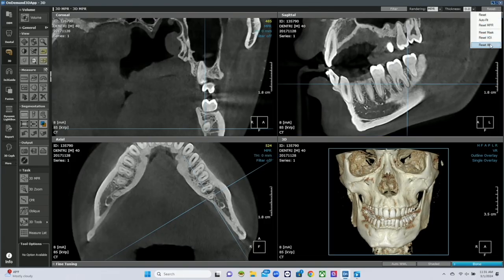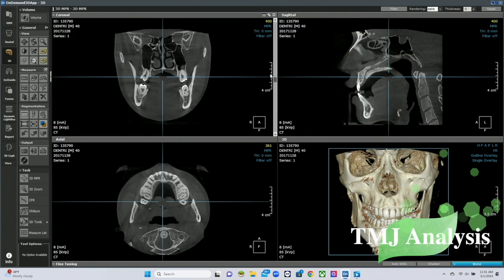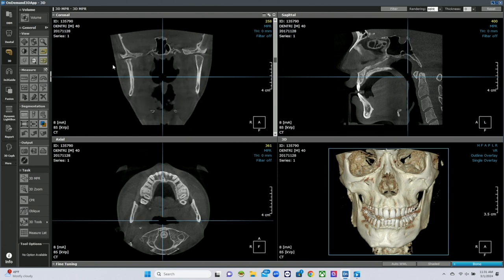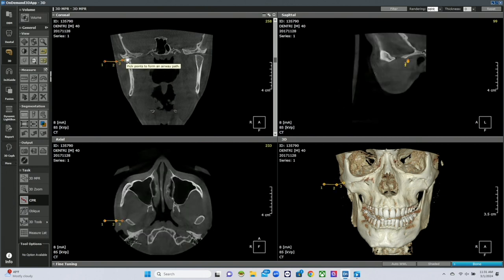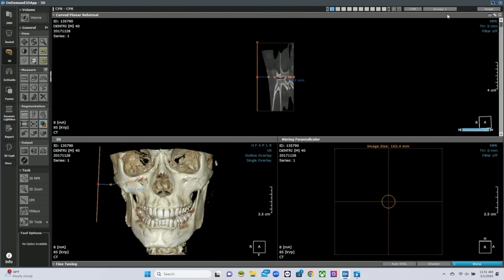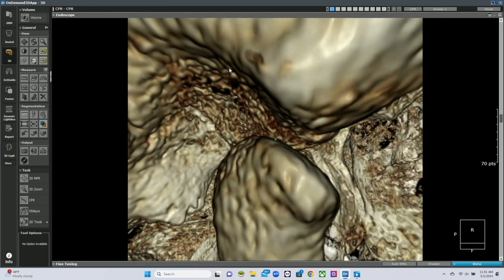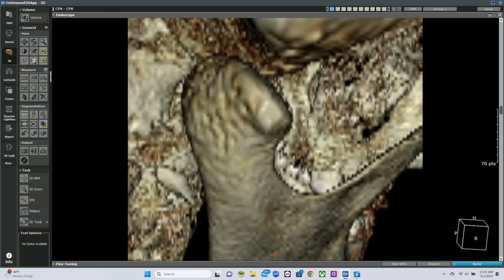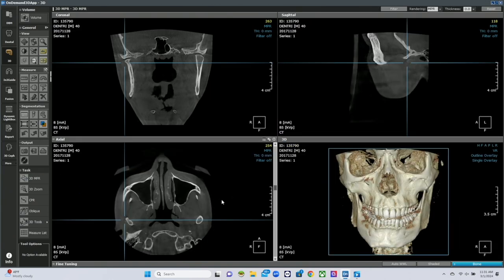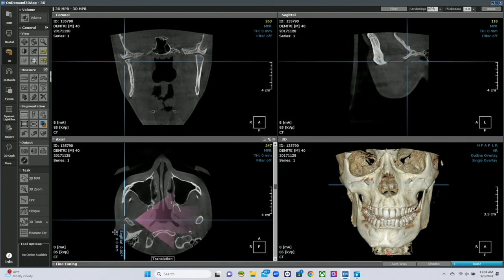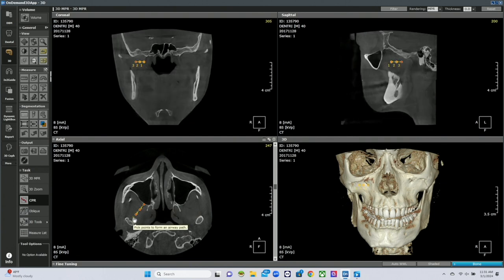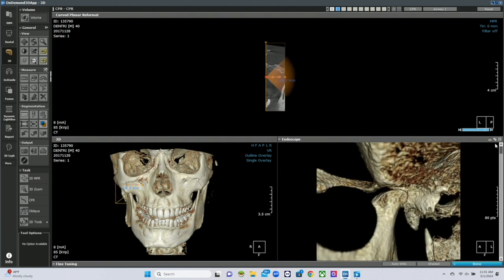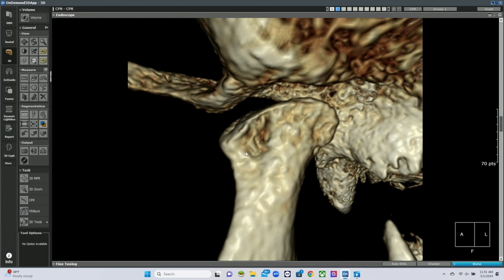You can also do TMJ analysis. We can come over here and look at the TMJs in slices, and use that same endoscopy tool on the TMJ itself — flying through to actually see the TMJ as it lays inside the joint, looking at the shape and how it sits. We can also view the face of the TMJ condyle from inside the face. One condyle looks like a nice robust round condyle — this one looks relatively flat. Flying through the soft tissue and looking only at bone, we can see this condyle that looked fairly normal from the lateral side now has a bony spur here, another bony spur here, and a flattening — early TMJ collapse we would have never seen from the lateral side.